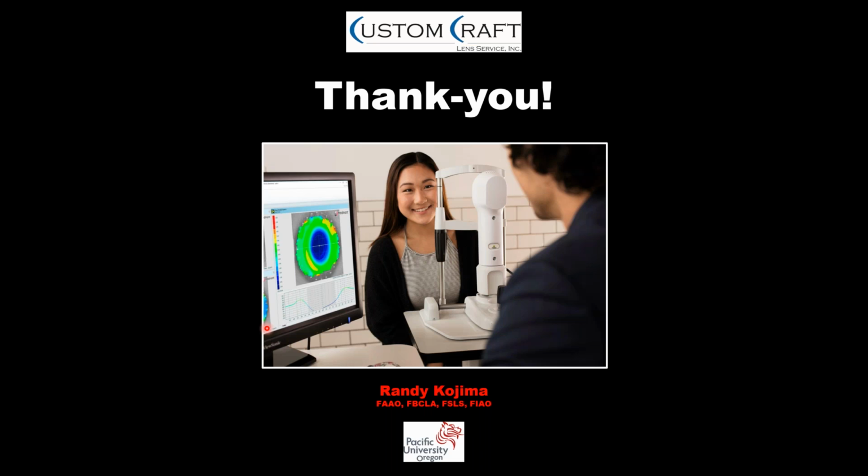Thank you, Randy. For the initial topography, do you prefer a composite image or a single central topography? Also, for follow-up captures, which do you prefer? I think that was already answered. The composite is a great image to have as your baseline map, but EyeSpace prefers a geometric capture rather than a composite capture. Darren, did I get that correct?